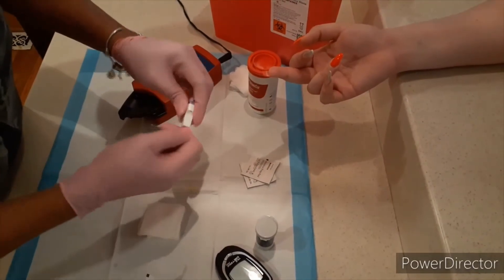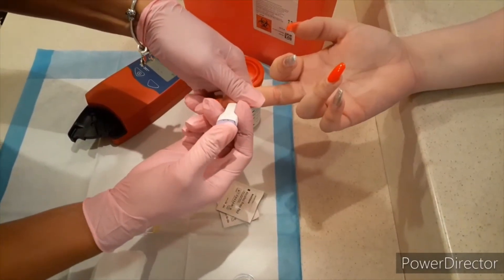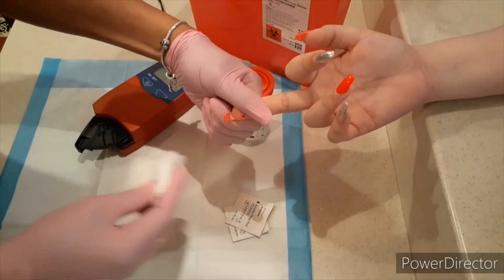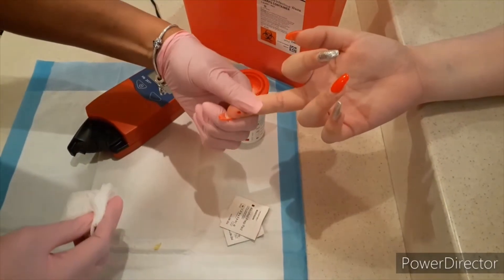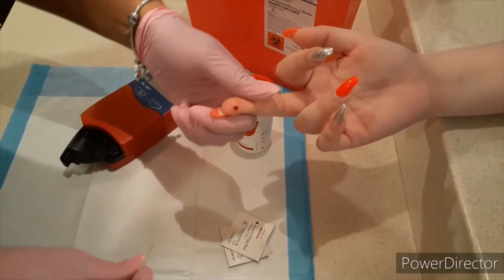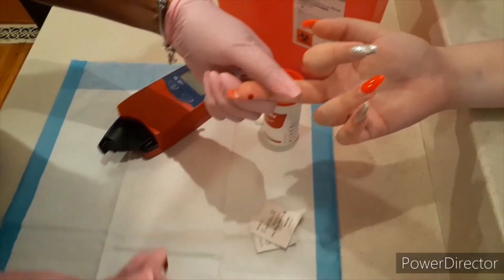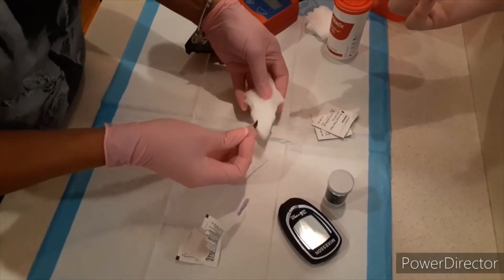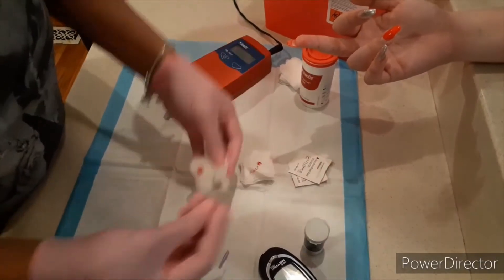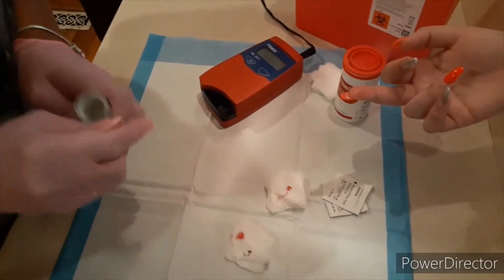After I make the stick, which is capillary puncture, I'm going to squeeze. I don't want that first blood, I don't want the second, and I'm going to go ahead and wipe off the third as well. Then we'll use this for our testing. I'm going to get a good drop of blood there, fill our microcuvette. I'll ask my patient to hang on a second because I've got another test. We'll wipe off any excess blood from the cuvette and place into our hemocube to get that result started.